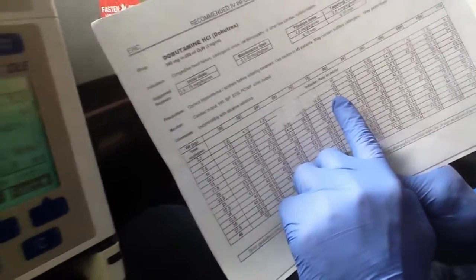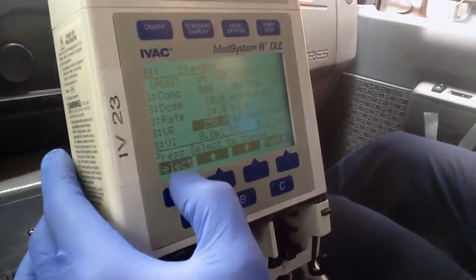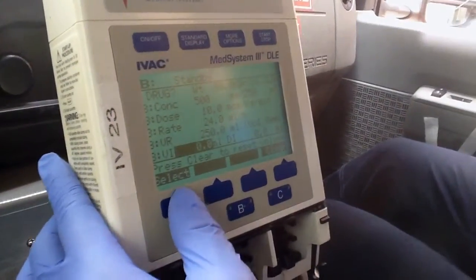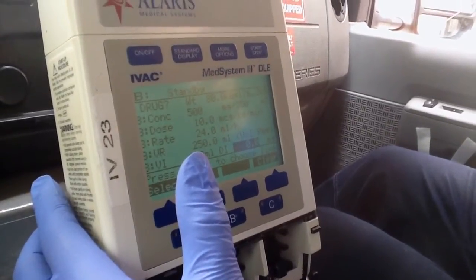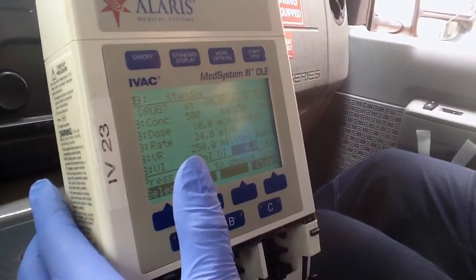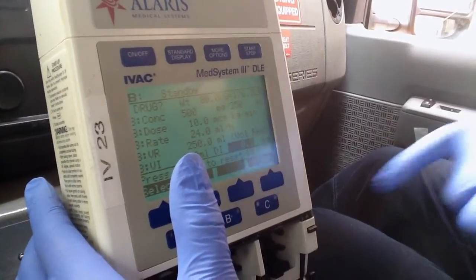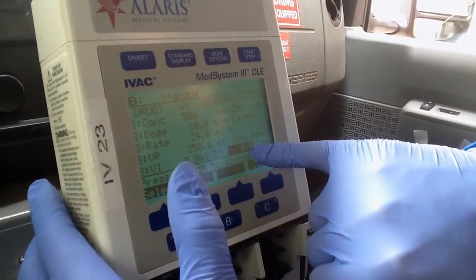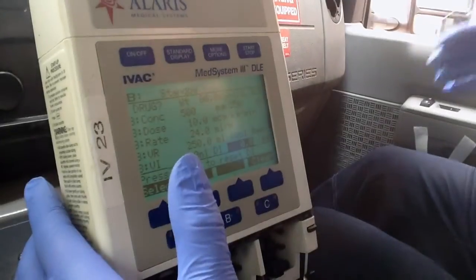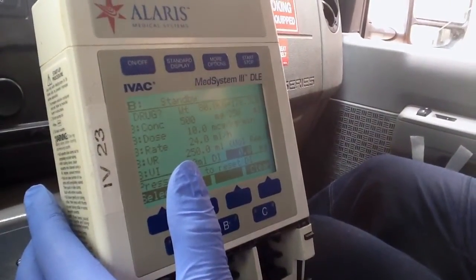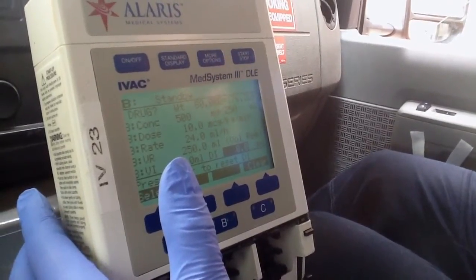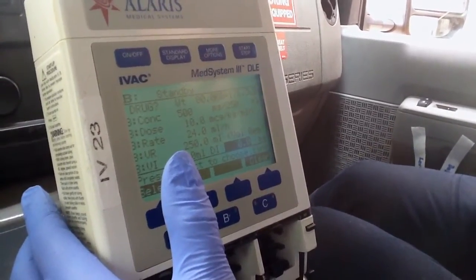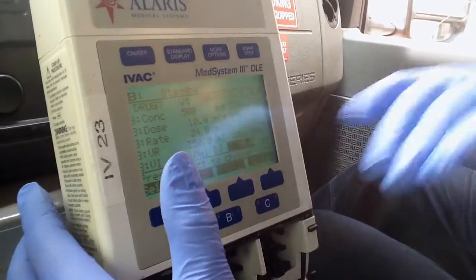Volume remaining — check the bag. Volume infused is none, dose infused is none. However, whenever you arrive at a facility and do a handoff, when the doctor asks how many milligrams the patient received, you look at dose infused right here and tell them — not mLs per hour, because mLs per hour is not a medication order unless you're infusing fluids.